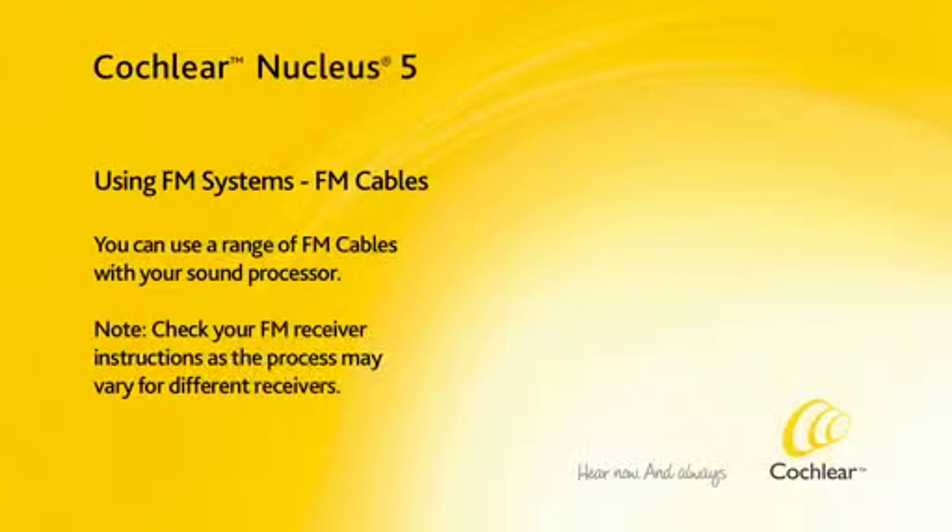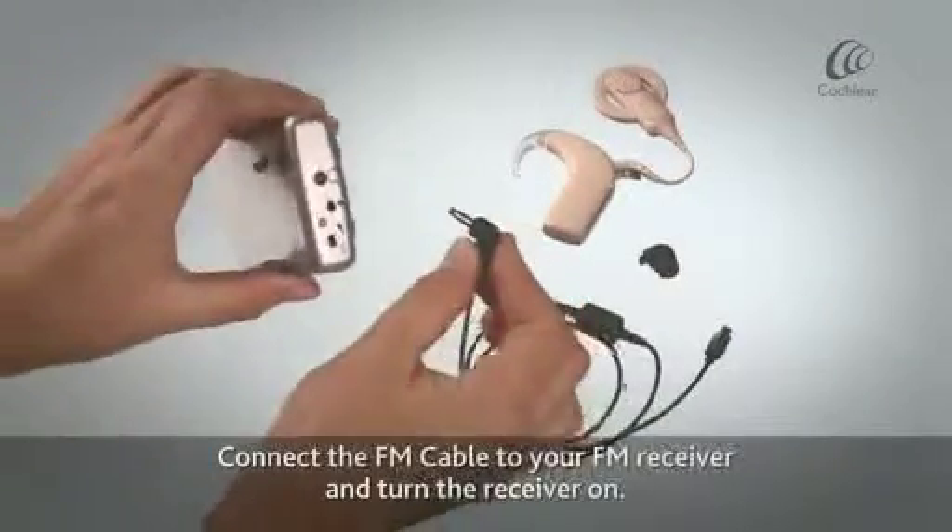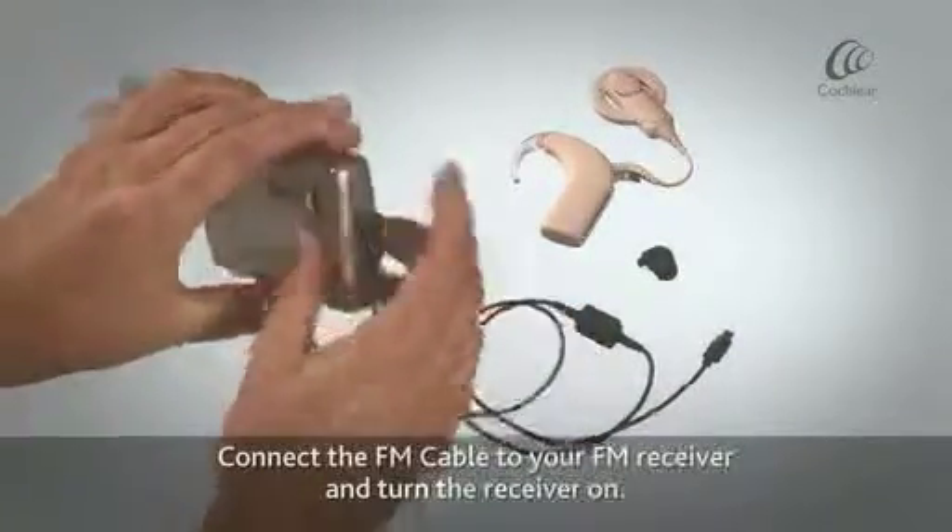You can use a range of FM cables with your sound processor. Connect the FM cable to your FM receiver and turn the receiver on.